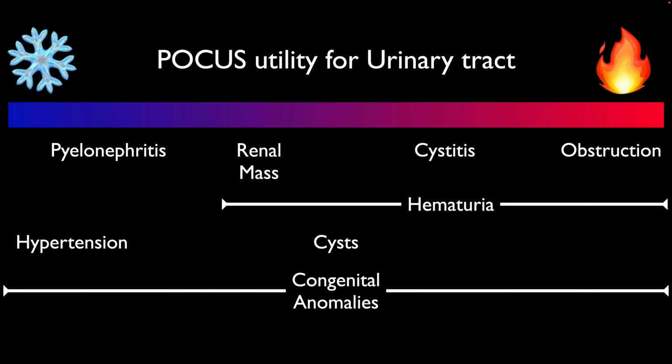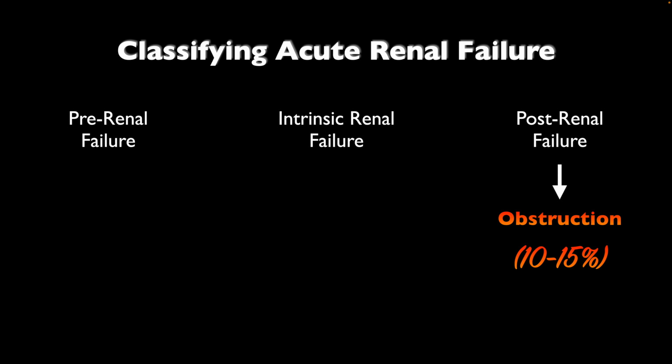Now keep in mind, we're talking about clinical ultrasound performed at the bedside by the clinician caring for the patient, not a consultative ultrasound where you order that test and they go off to radiology and have it performed by a sonographer, which is later interpreted by a radiologist. Instead, we are talking about what utility we can have to make real-time decisions at the bedside while we're caring for that patient. And the big thing for us with clinical ultrasound is that we're going to be looking for signs of obstruction. Obstruction, even in acute renal failure, is the key to what we're evaluating for.